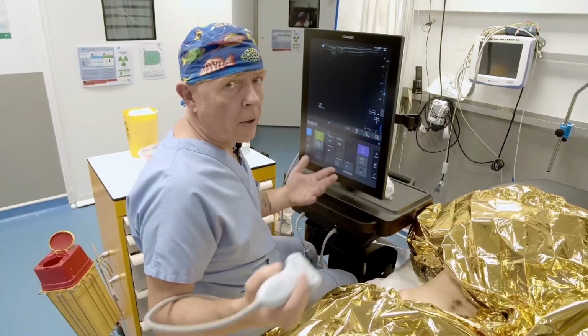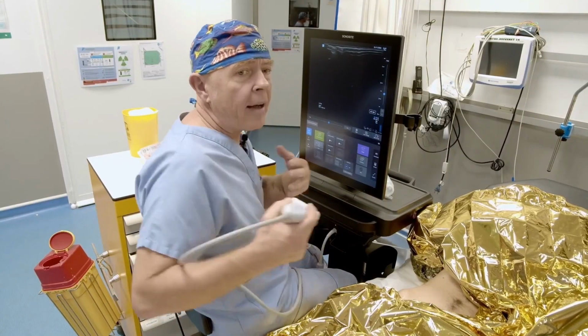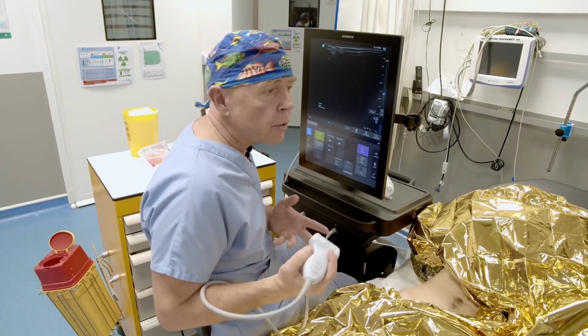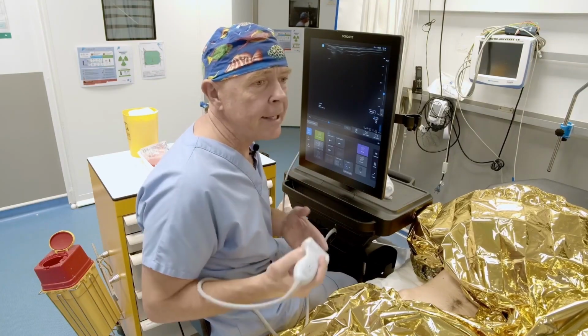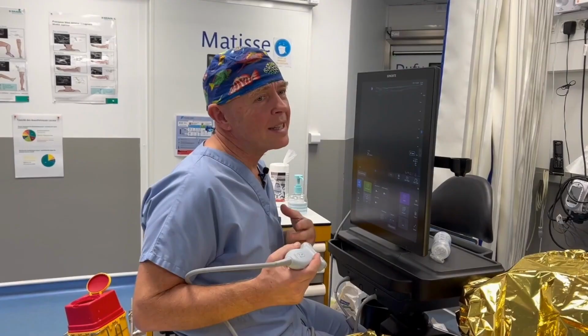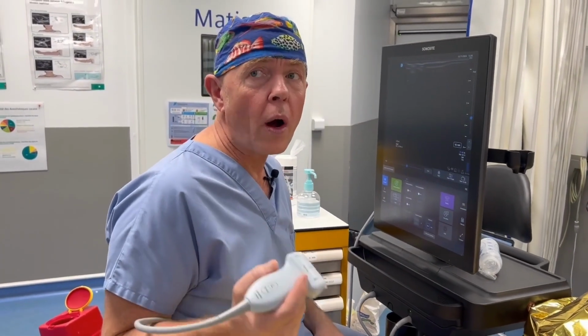Regional anesthesia. So the tap block, so that's one of the blocks that is both the easiest to identify because the sonoanatomy is really very simple and well known, and to achieve maximum clinical effectiveness, which in my opinion is actually quite complicated, because the effectiveness of your block really depends on where you position your probe.